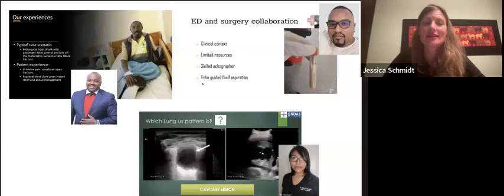Also on this website, just added earlier this year, is a really cool series of lectures from people on the ground who are using ultrasound in limited resource settings in innovative ways. These are from Kenya, Haiti, and Peru, respectively, talking about fascinating uses of ultrasound in their clinical practice. For instance, Dr. Romeo Wahome, who's in the blue suit from Kenya, is doing serial popliteal nerve blocks on patients with lower extremity injuries from motorcycle accidents, which in my clinical context would be unheard of because of concerns for compartment syndrome. And he's had amazing success doing that.